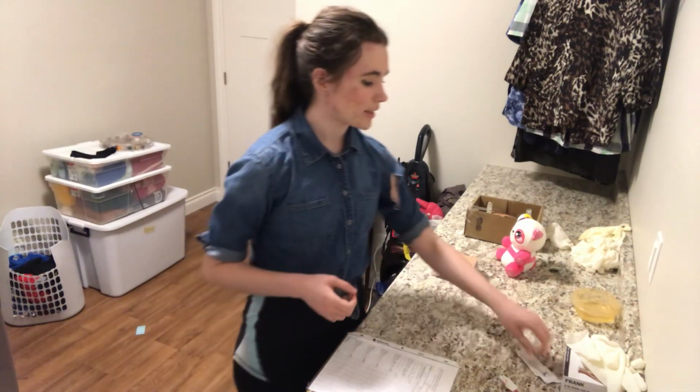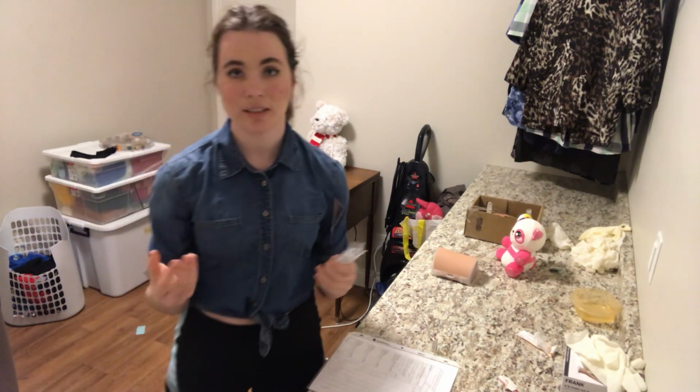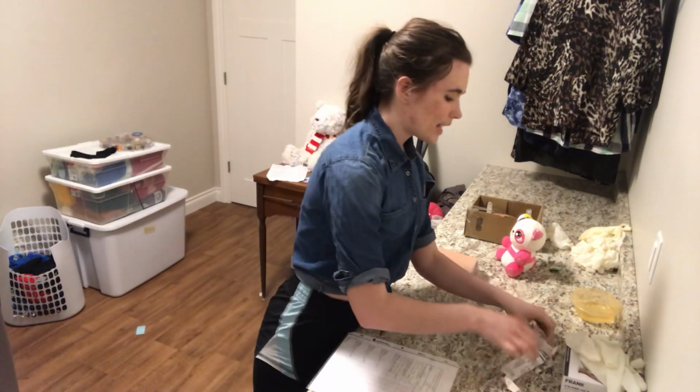I'm going to select out my correct needle. So I've selected out my 3 ml syringe here, and I've chosen to use this because I find that the luer locks are much more stable and I can still draw up half an ml very accurately. And then I've also got my 25 gauge 5/8 of an inch needle.